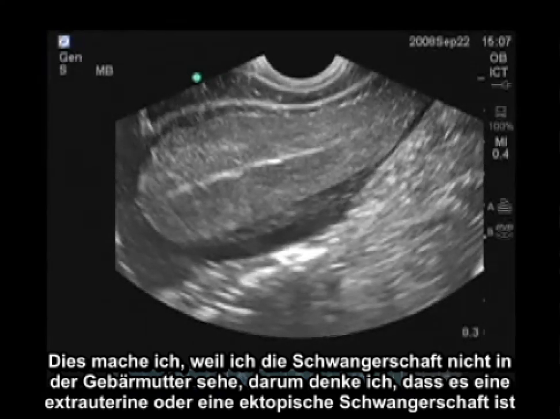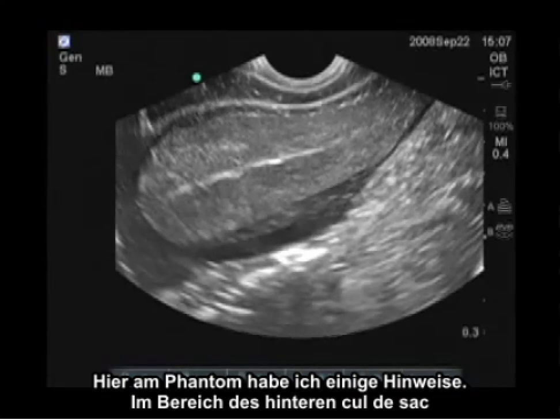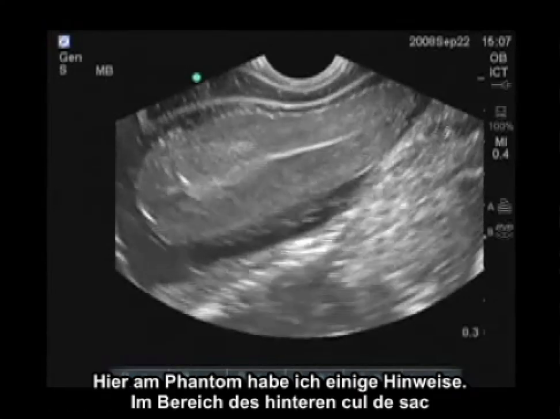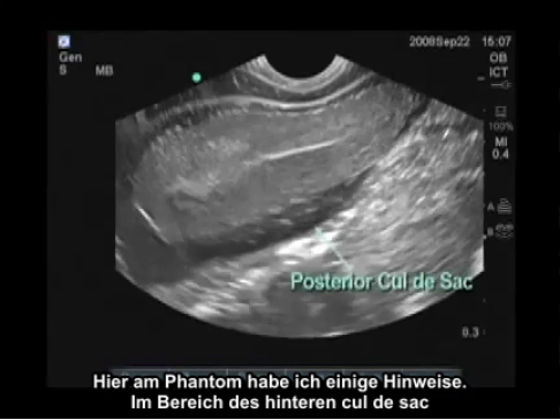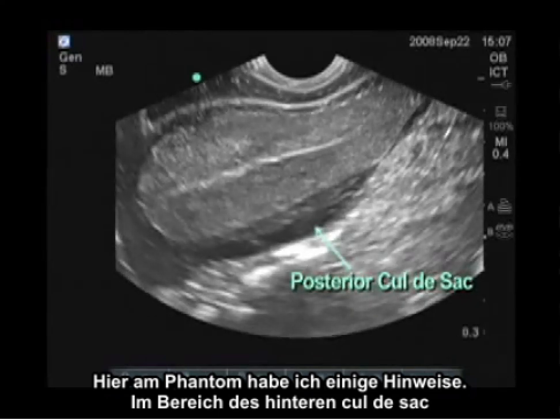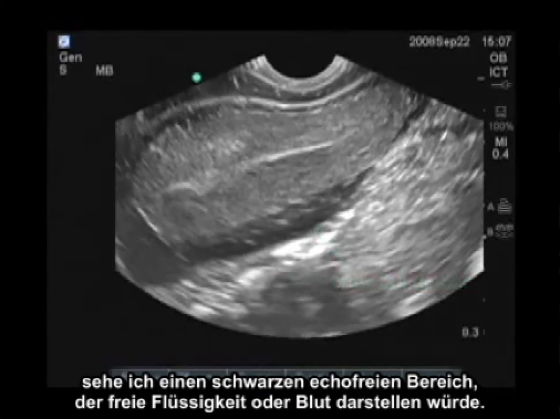I do have some hints using this phantom. In the posterior cul-de-sac region, I'm seeing a black anechoic area, which would represent free fluid or blood.